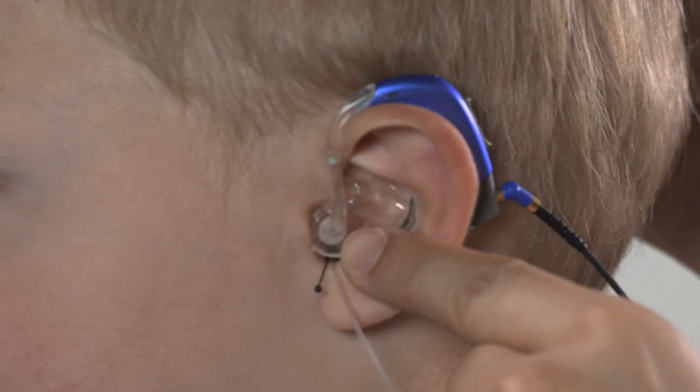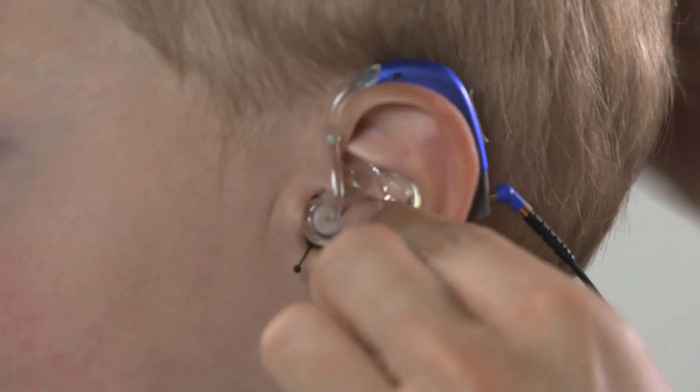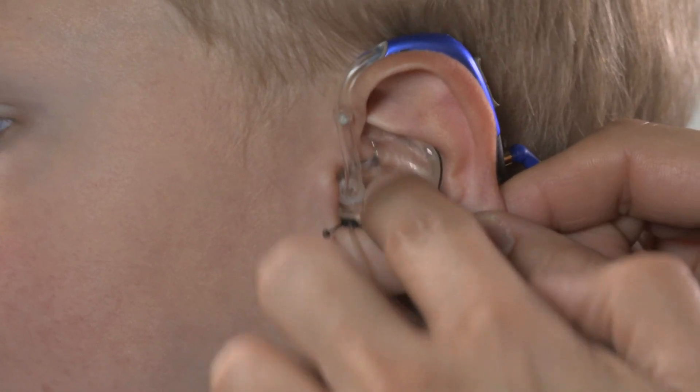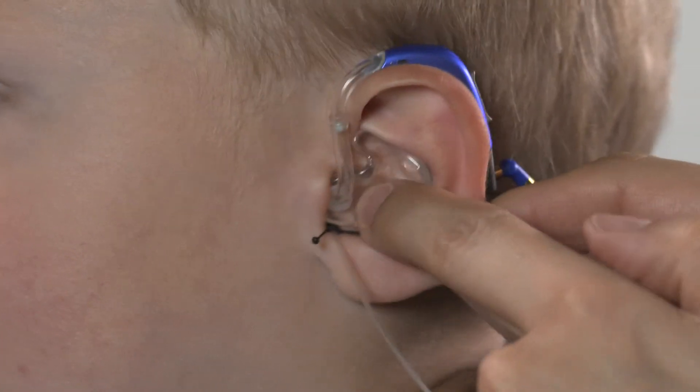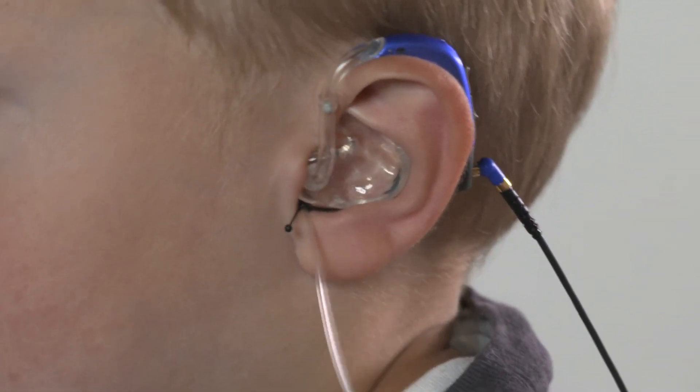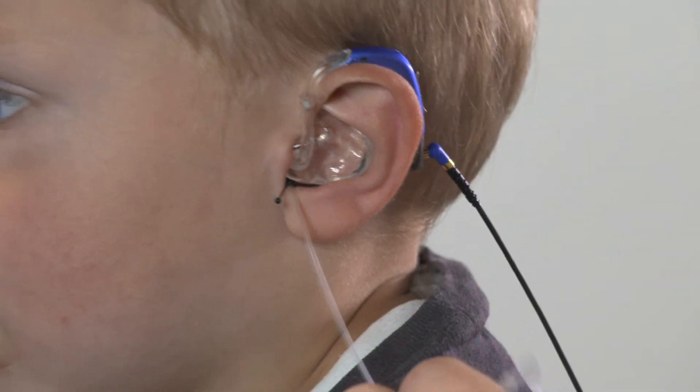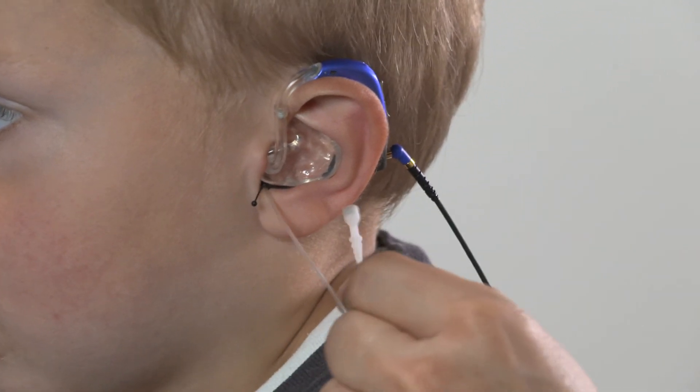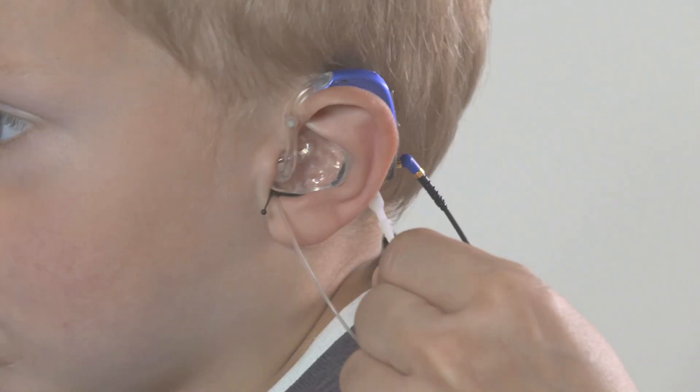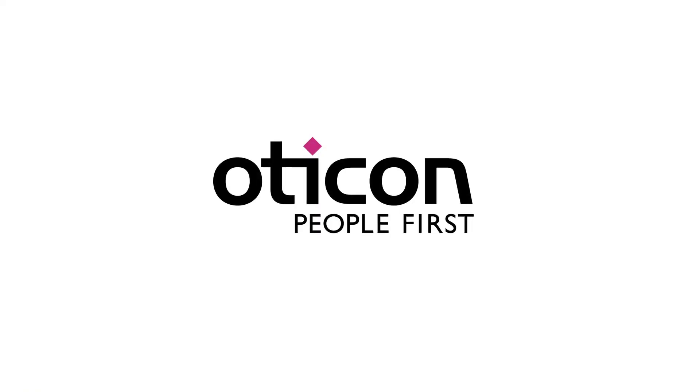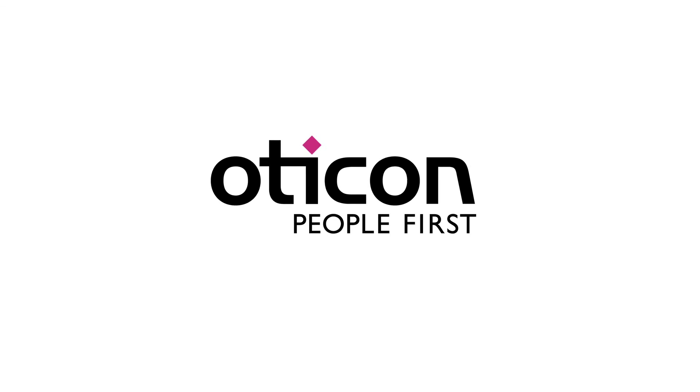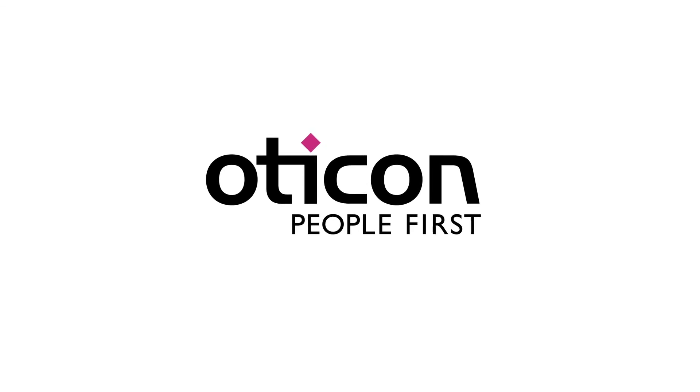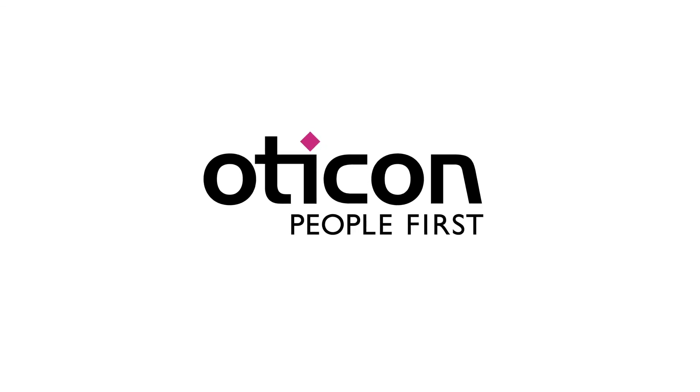With the EZ RECD, no external equipment is necessary. Individual ear acoustics are taken into account by measuring directly using the child's ear mold and hearing instrument. For more information on the EZ RECD, please visit the Oticon People First channel on YouTube.